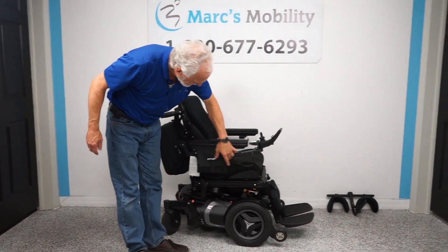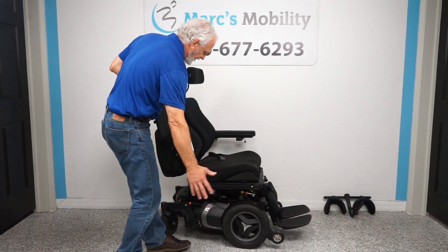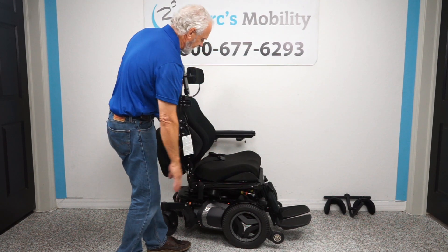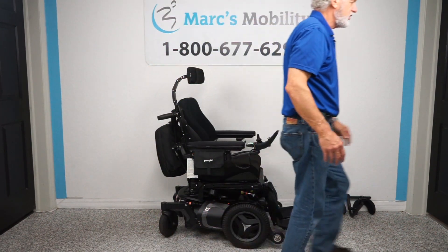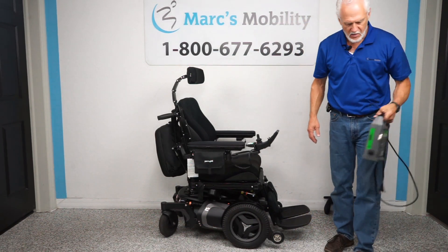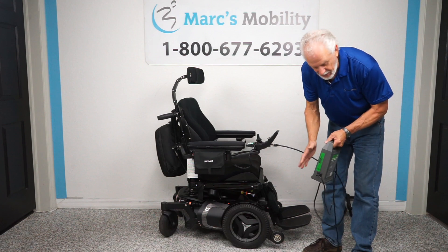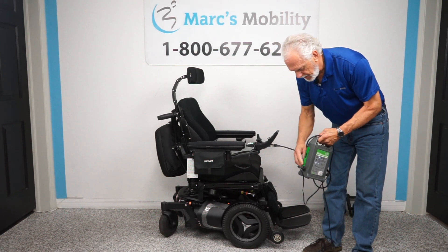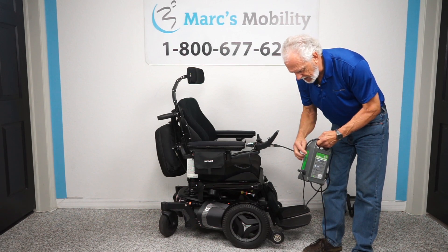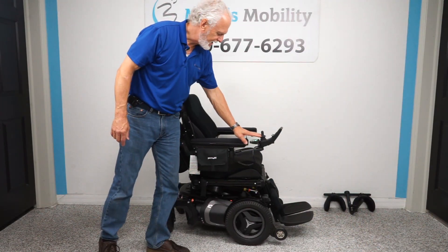If you transfer from the side, there's nothing obstructing you — easy side transfer. For charging the batteries, plug the charger into the charging port and when the light reaches the top it's fully charged. These are smart chargers that know when to stop.